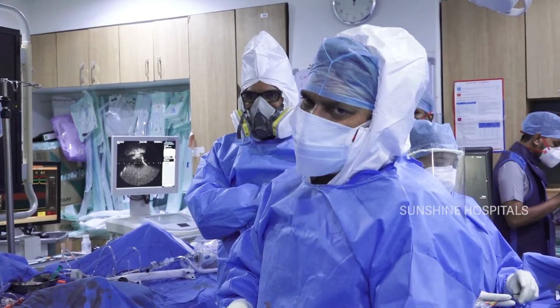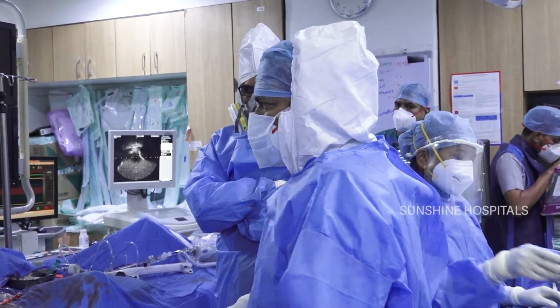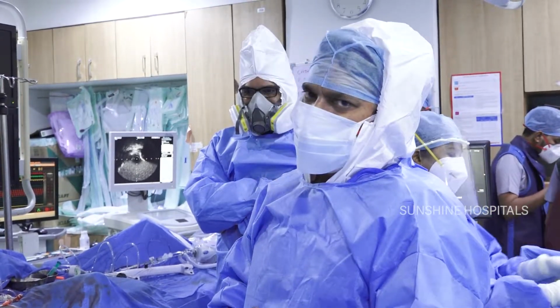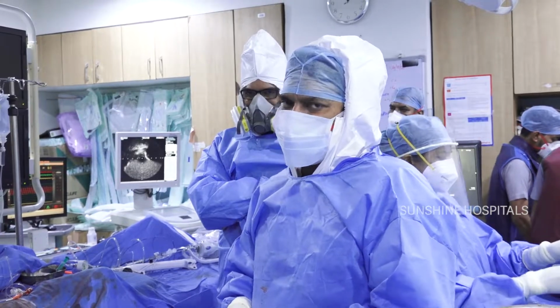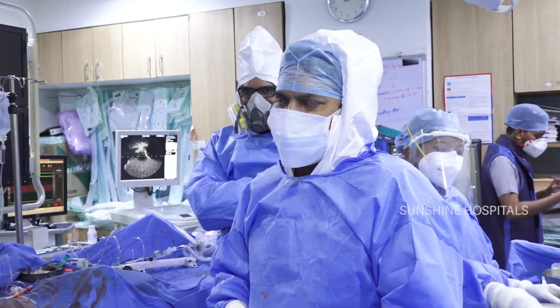Initially they tried to cross the lesion in one of the peripheral centers, but they were unable to cross. Then they deferred the procedure. Then the patient came to us with a history of an uncrossable lesion, balloon uncrossable, for PCI of the LAD.